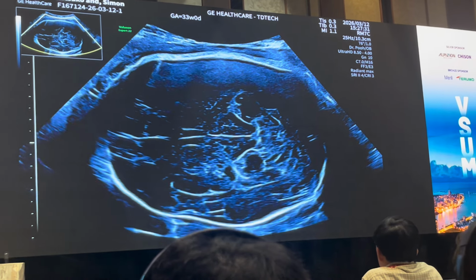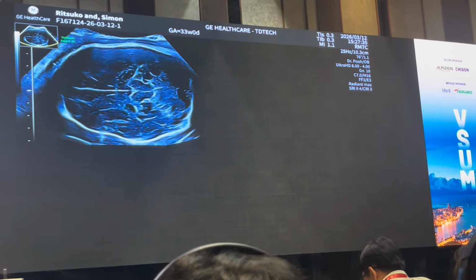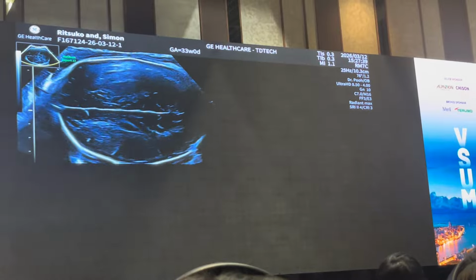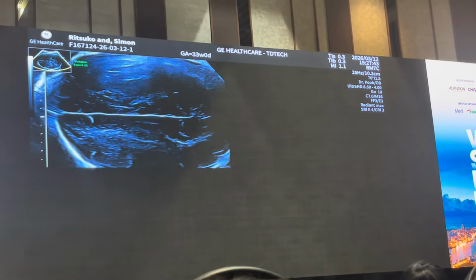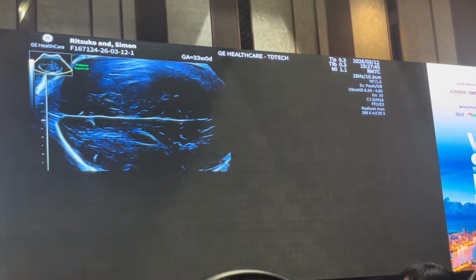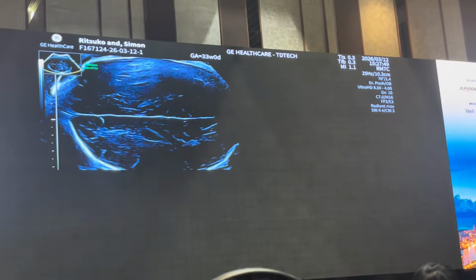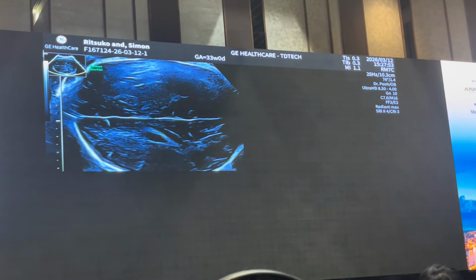And we start with a very basic examination, which is the ISUOG section analysis. So for the ISUOG section analysis, we're going to do a whole quadrant. I'm going to magnify the image up, and I'm going to start off looking at the midline falx. I can only see one line of the midline falx, and it extends all the way from anterior to posterior. I can see here the cingulate gyrus coming in at this point here.